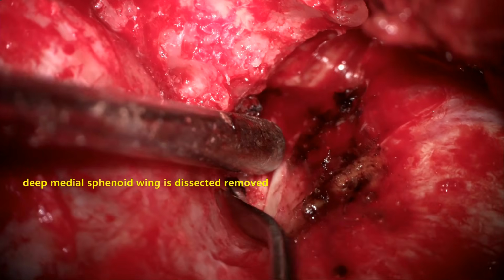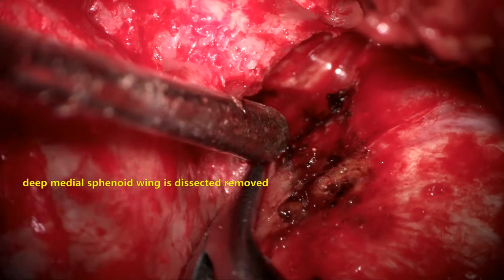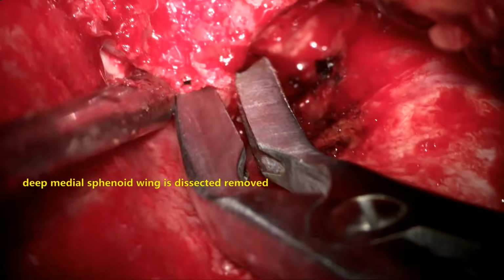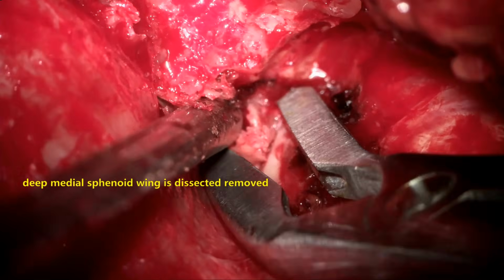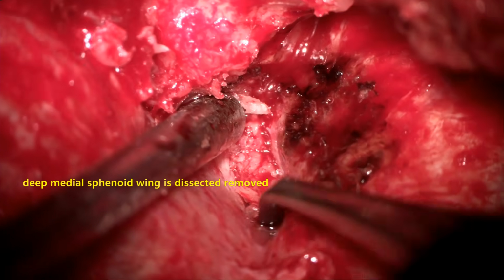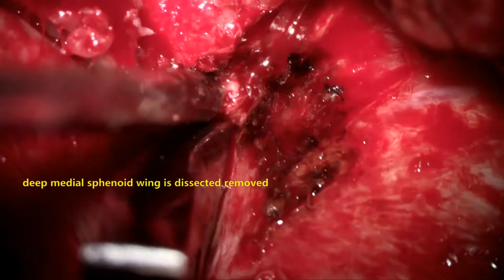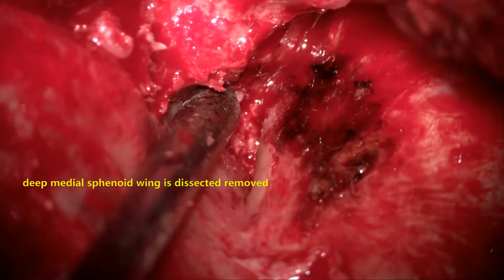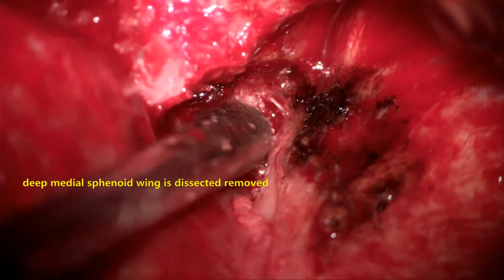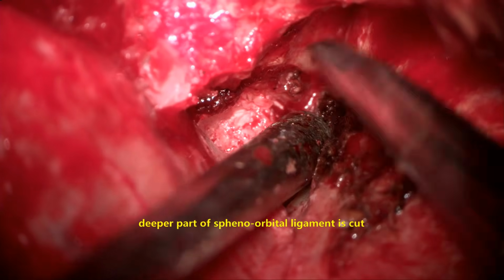These steps are done under high illumination and high magnification, meticulously and slowly, so as not to injure the intradural structures. All movements should be slow, gentle, and meticulous with fine instruments. That is the medial sphenoid wing. We have reached it after removing the lateral sphenoid wing. This should be done flush with the middle and anterior skull base, reaching up to the anterior clinoid process.